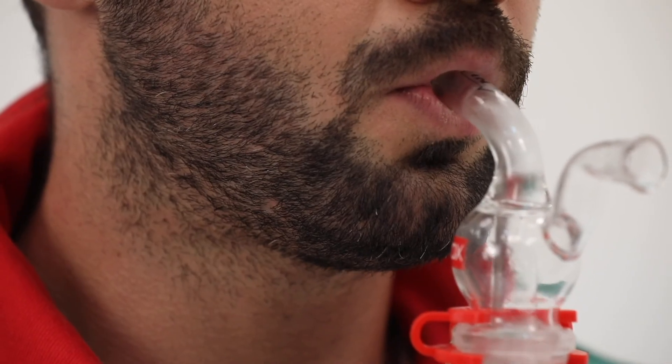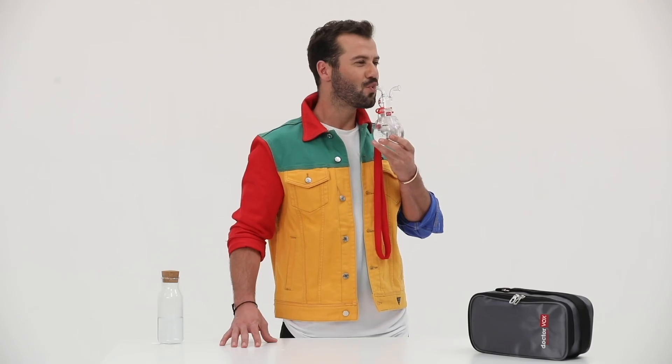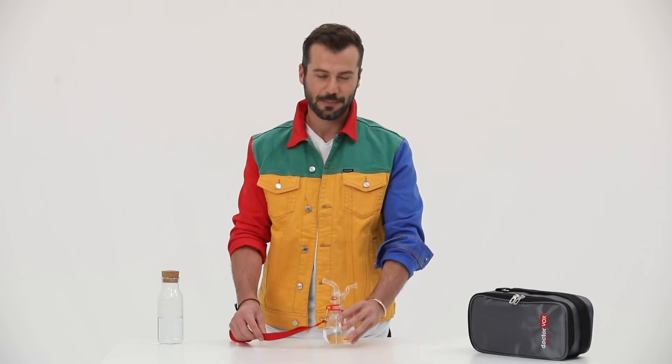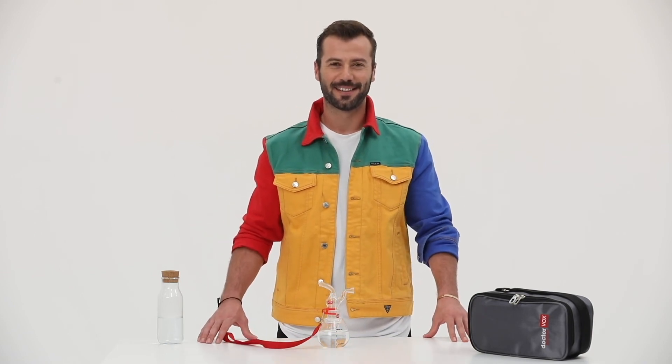Vocal health is more important than anything else for a voice professional. A sustainable voice is the most important thing for a singer. For this reason, the Dr. Vox Voice Therapy System is a favorite method for all voice professionals to use their voices at the best level.